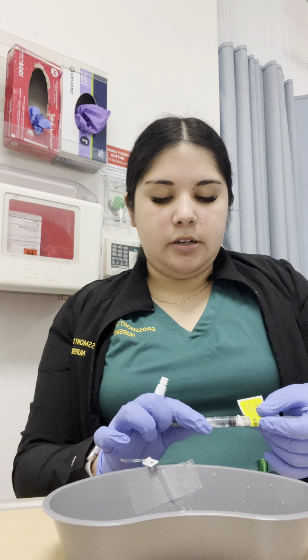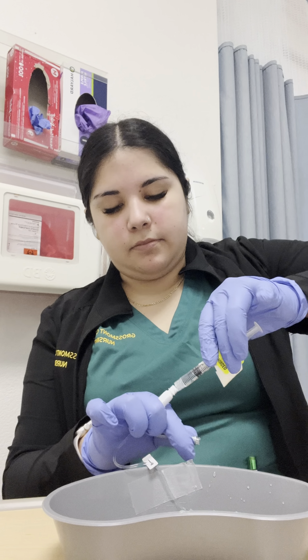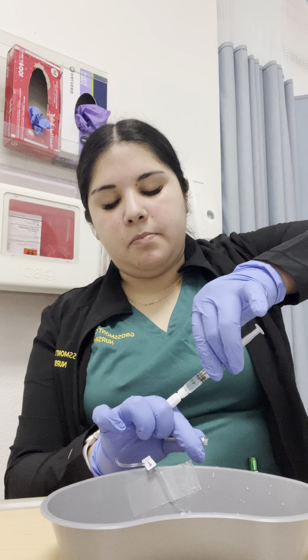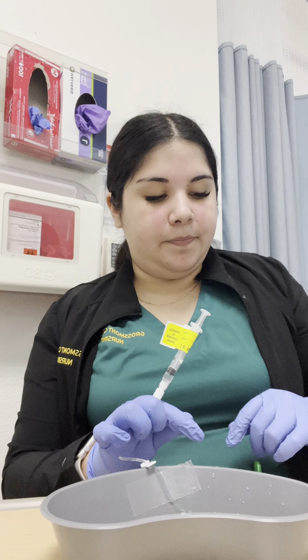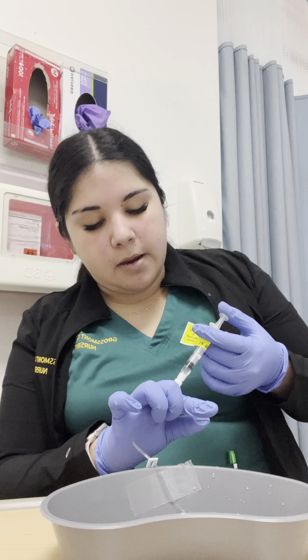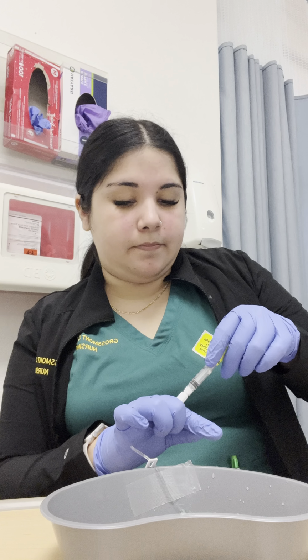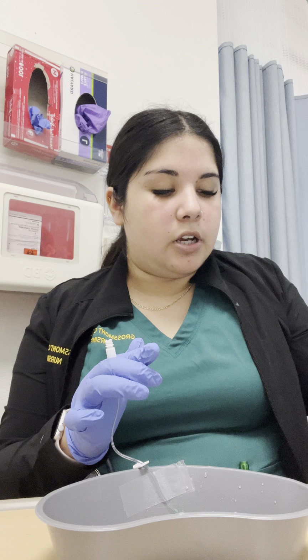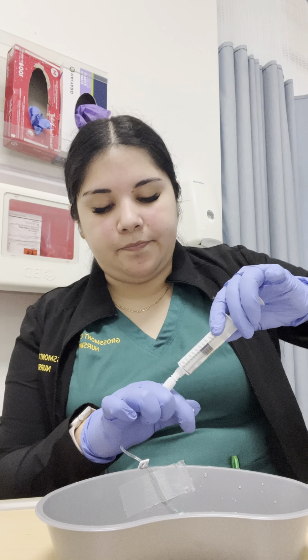Taking my medication, I will remove the cap and attach. And again, my push rate is going to be 0.5 mLs every 30 seconds. So I'm going to go ahead and push that first 0.5 and waiting 30 seconds. Once those 30 seconds are up, I'm going to push the remaining 0.5. And I'm going to wait 30 seconds because there is still medication in here, which I'm going to flush into the blood vessel with my normal saline.